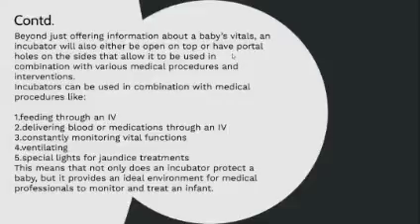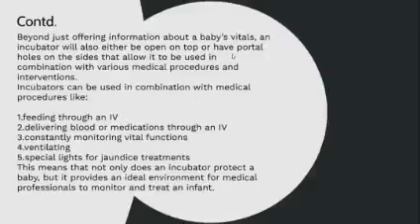Some babies are born with pre-delivery jaundice, so special lights are used for treatment. Incubators do not only protect the baby, they also provide an ideal environment for medical professionals to monitor and treat an infant and take care of them.